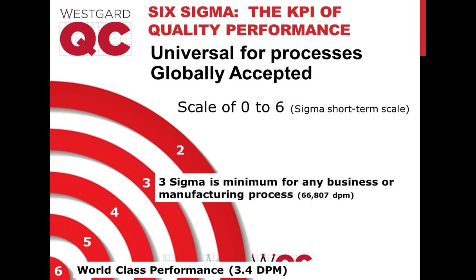So you run a process 1 million times, you run 1 million different patient samples. How many of those are going to have defective results or false positives or false negatives? And the DPM, defects per million, is what equates the number of defects to the sigma level. At 6 sigma, it's less than 4 defects per million. So the DPM is 3.4, actually. And then at 3 sigma, it's about 67,000 defects per million. Sometimes you'll also hear it called DPMO, which is defects per million opportunities.